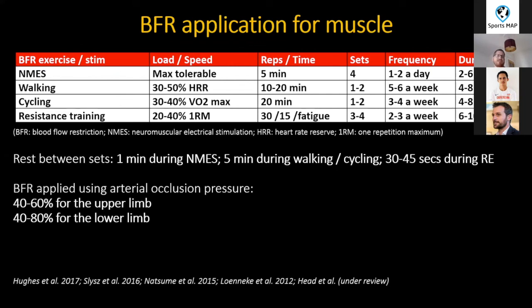From there, you can progress it by increasing the pressure or increasing the intensity of the exercise as well. Another quick pointer for resistance training: you want to follow a rep scheme, traditionally 30, 15, 15, 15. But I use the first set to dictate how hard the exercise is. You're aiming for 30, so if they can only manage 10, you want to make it easier. And if they can manage 50, you want to make it harder. That's how I use it.